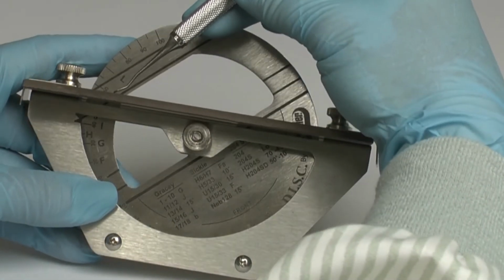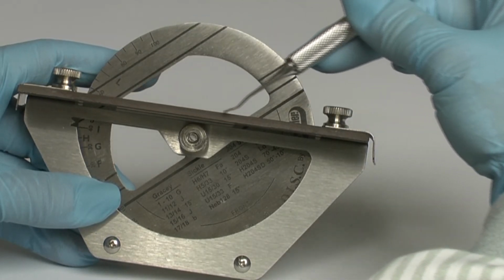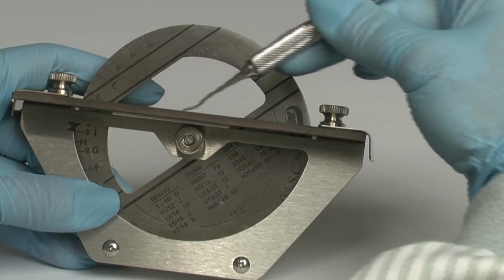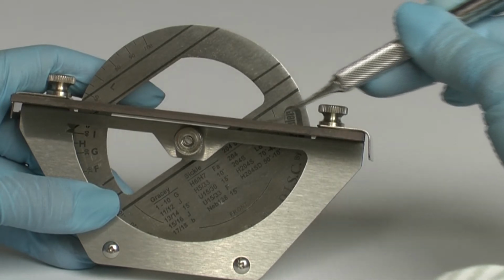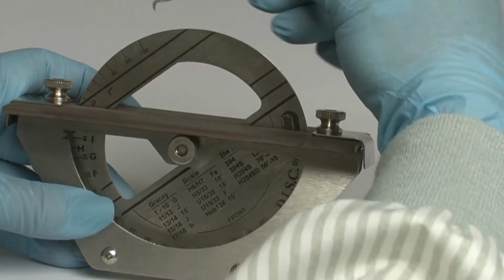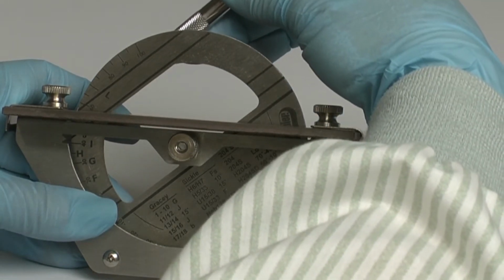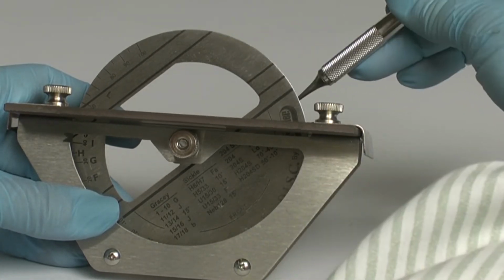Place the 35 end on the front stone so the tip faces the wheel as the handle of the instrument is aligned parallel to the bold reference lines on the wheel. Then, simply move the instrument blade across the stone while keeping your wrist steady so the instrument remains aligned with the bold reference lines during the entire stroke. Flip the instrument to the 34 end. Place on the rear stone with the tip pointed towards the wheel and handle aligned with the bold reference lines. Repeat the same sharpening step.